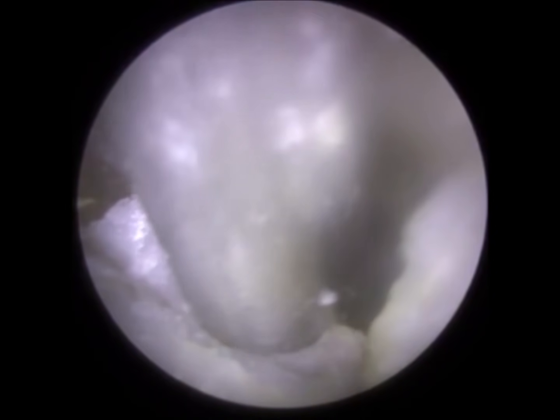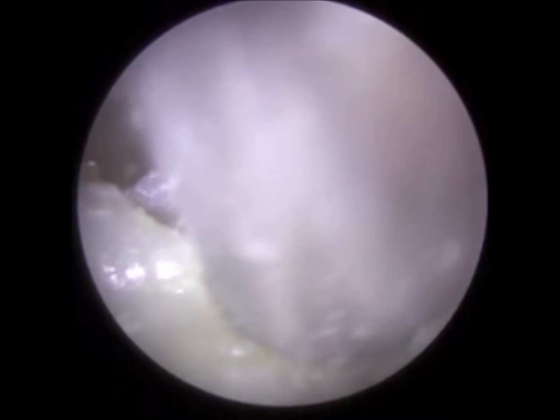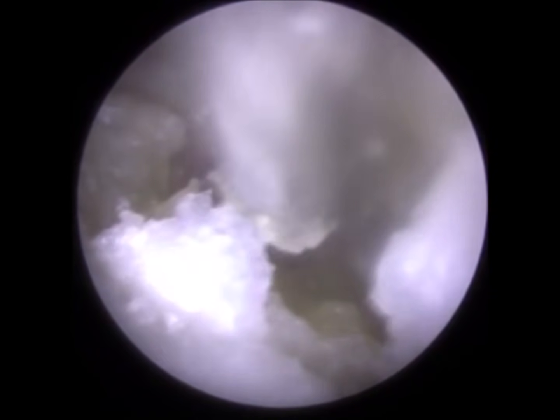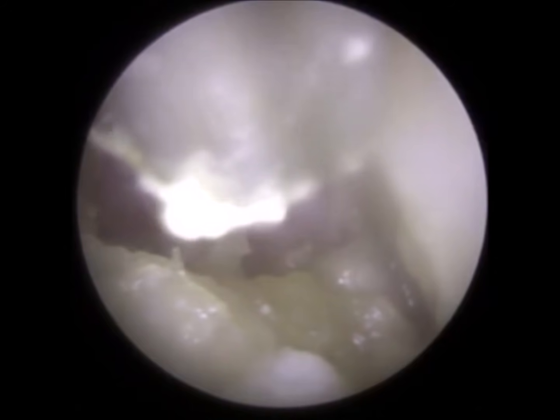Because it's got a lot of keratin, sometimes if you just peel it laterally from near the entrance, you get a whole peel all the way towards the eardrum. But this keratin is quite thick, so you're almost having to put a lot of pressure when you're lifting it off the canal wall, and then it shreds into little pieces. So it wasn't one of those skin peels where you can literally peel the whole ear canal in one go. It was just suctioning parts and bits and bobs of dead keratin a bit at a time.